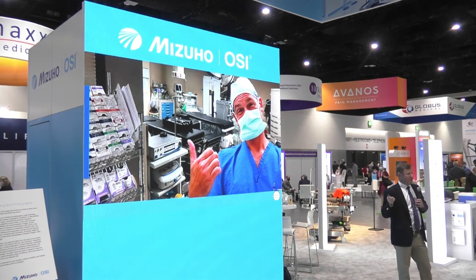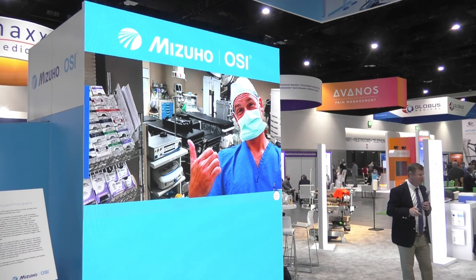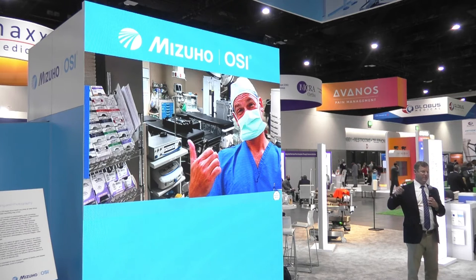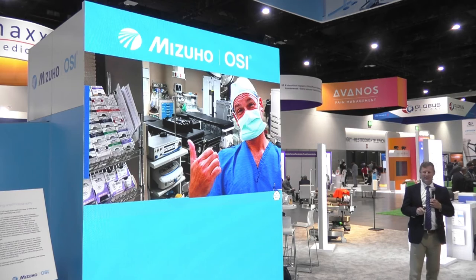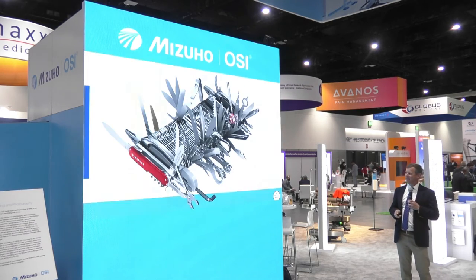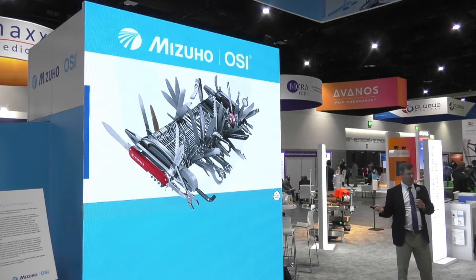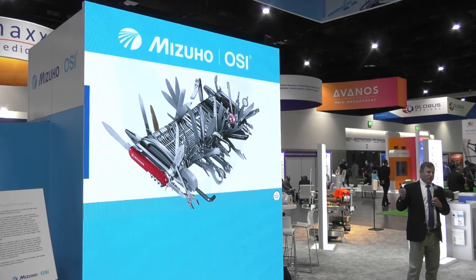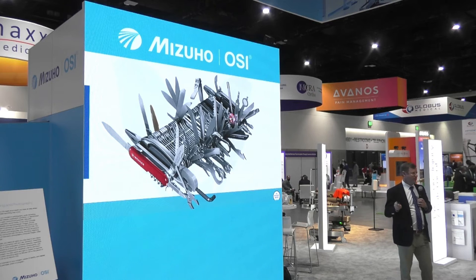There is one table out here whose unique sales proposition is how well it fits into a cabinet in your ASC. Well, I'll tell you, if your major sales proposition is how well it can be stored, then it's probably not very good for your business. So I would tell you, you probably shouldn't be picking that one. There's another one that argues that it can do everything. I mean, it's a shoulder table, it's an elbow table, it's a hip table, but you start to get so unwieldy with the functions of the table that it becomes self-defeating as well.